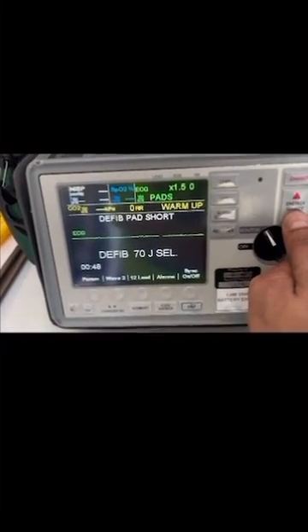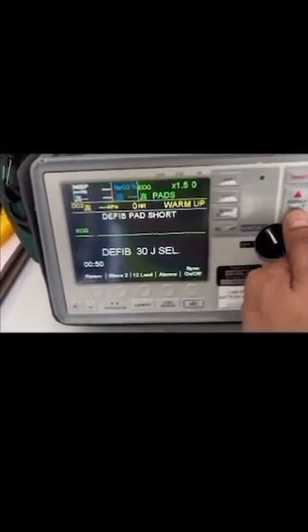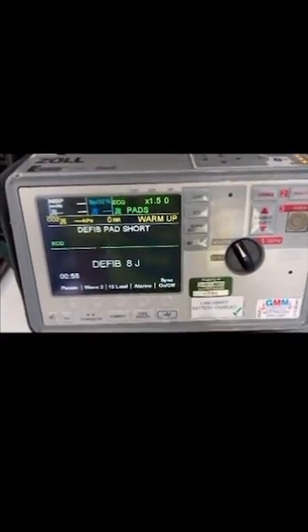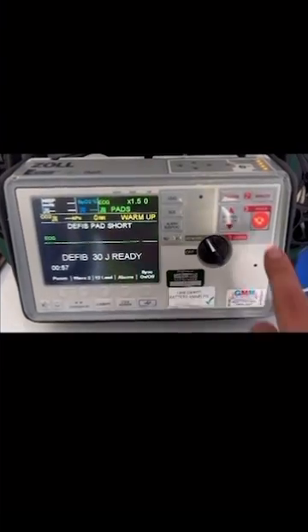Step four: set the joules to 30 joules as stated on the testing port. Step five: charge the defib at 30 joules, then press the shock button, which will cause the defib to run a self-test.